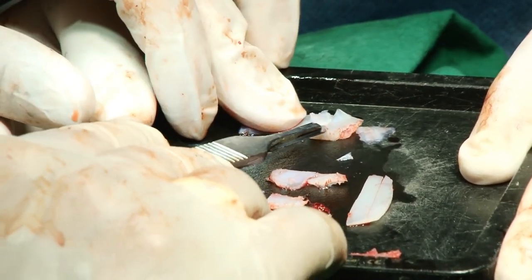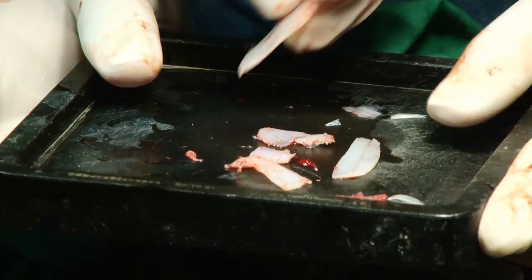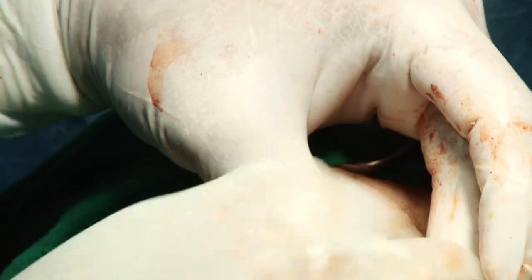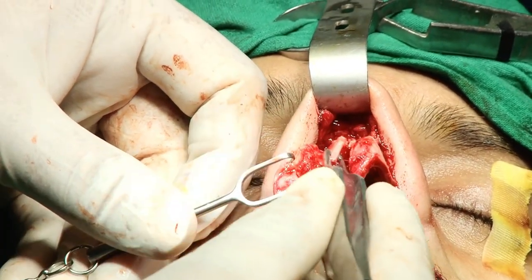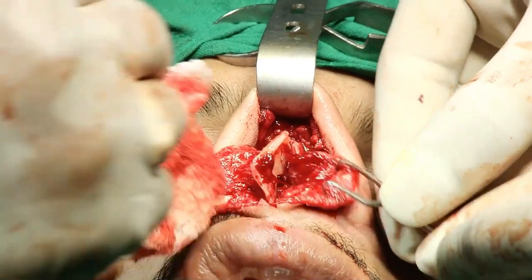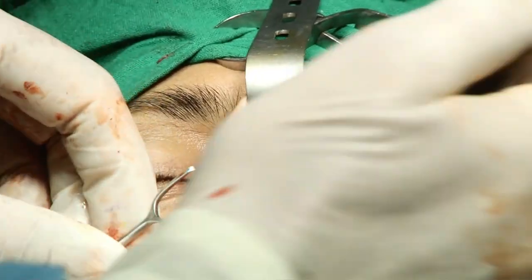First, you deploy the mucoperichondrium and ensure both sides of the mucoperichondrium are intact. Put in the self-retaining retractor and clean the field. Yes, put the self-retaining retractor, and the lateral crura retractor. This is the main culprit, it is like this, and that's why the entire tip is deviated. So it's a very important thing that when you examine your patient, you judge what underlying deformity the patient has.